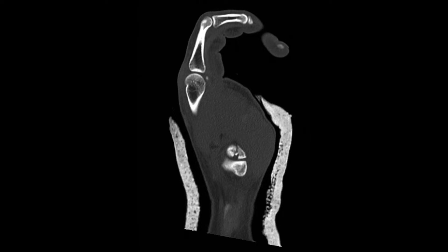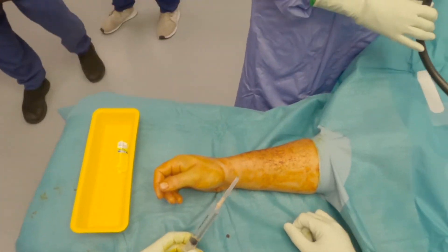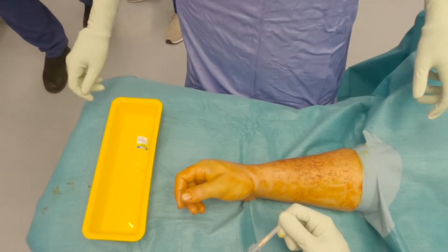The operative strategy was to attempt closed reduction of the fracture with longitudinal traction, followed by K-wire stabilization. If closed reduction was not possible, open reduction and internal fixation with plate and screws via the Wagner approach would be performed. Fortunately, and in spite of the die punch fragment, closed reduction was effective.